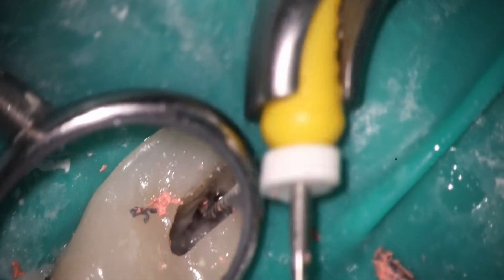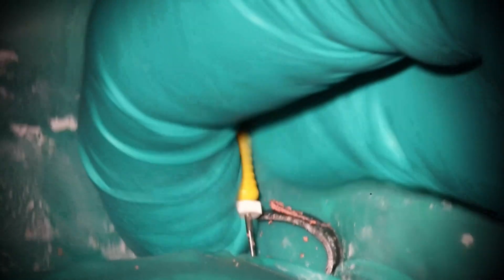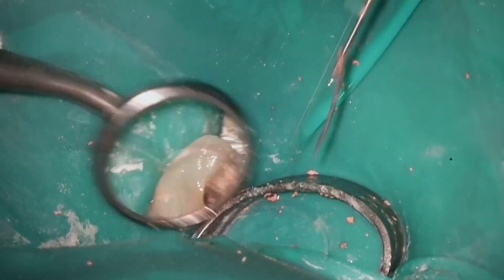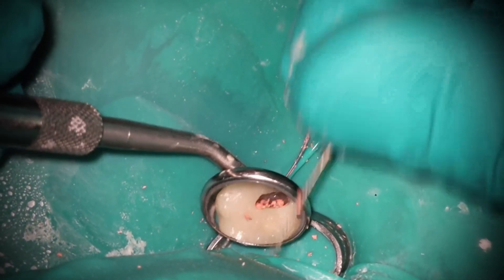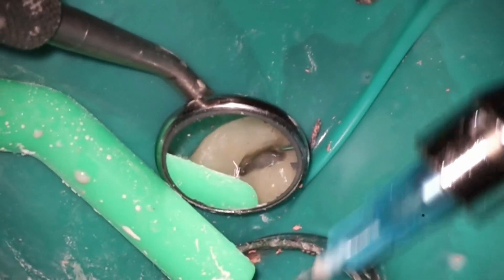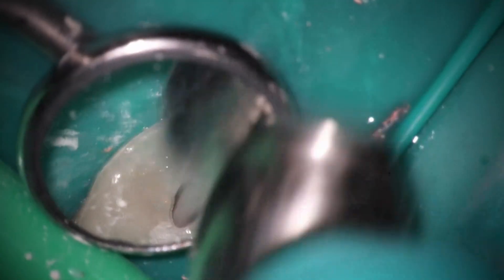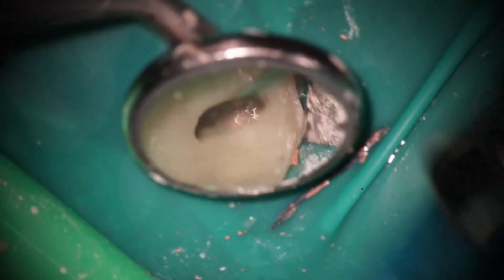For this one I wasn't able to get as much purchase because the MBs kind of joined up — it's more of a broad oval. What I like to do is wind down and then lift up. The plastic carrier is a lot softer than the actual dentin, so the flutes of the hedstrom engage the plastic a little better, and when you pull, it pulls up on the plastic and not the dentinal walls. Sometimes you'll find isthmuses where gutta percha is stuck, and you actually have to go back in with your high speed and then rinse everything out.